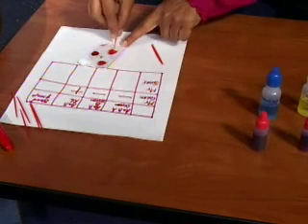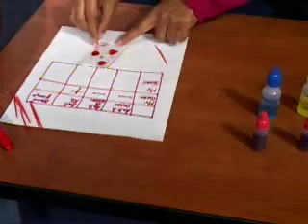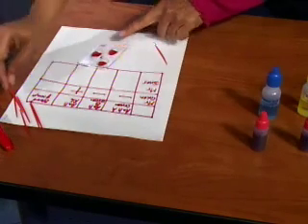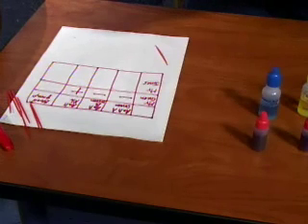And I'm waiting to see if I see any agglutination. I'll just wait a few seconds and observe carefully.